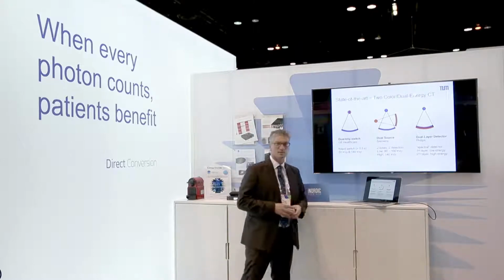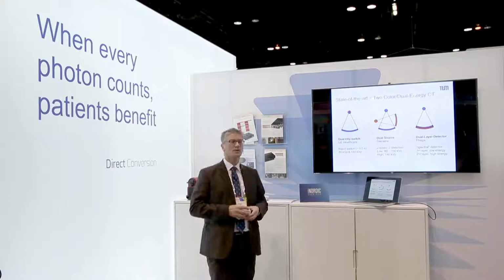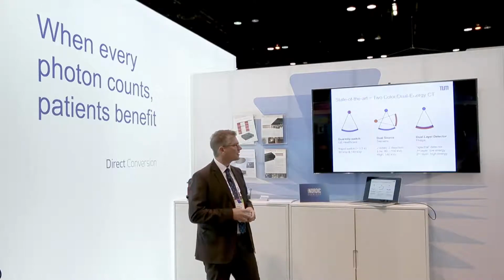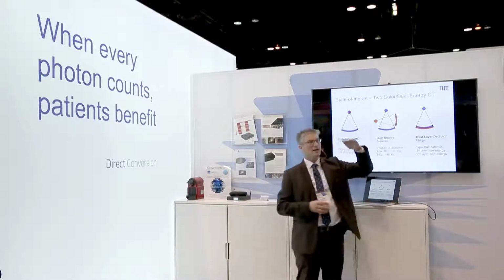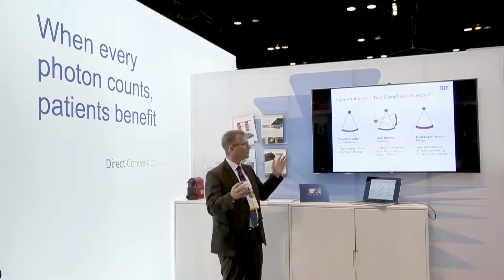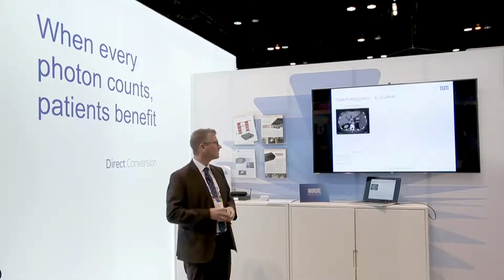There's another system by Siemens that uses two detectors and two sources, and in that way you can configure one at one energy and the other one at the other energy and get two energy bins in your measurement of the image. And then finally Philips came out with a spectral separation on the detector by actually putting two layers on top of each other. The first layer would take more the lower energies and the lower layer takes the higher energies. So in that way you also get two energy bins. And these systems are actually in daily use today in most of the big university clinics.